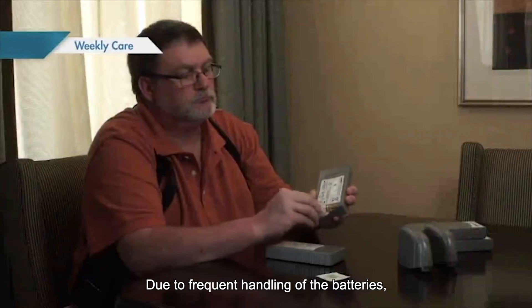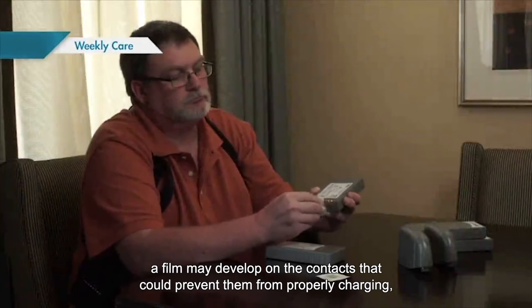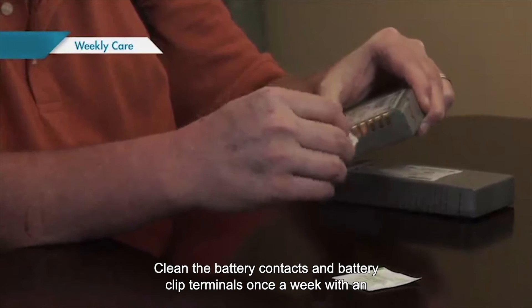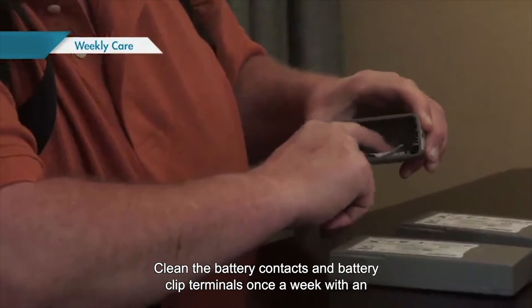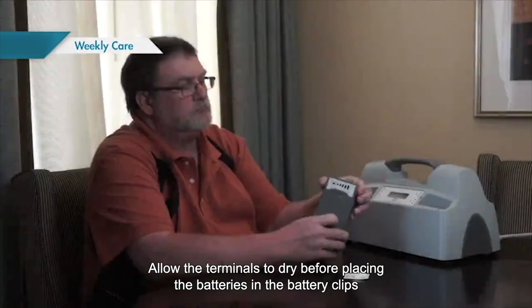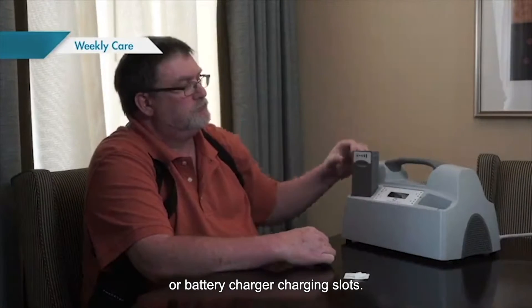Due to frequent handling of the batteries, a film may develop on the contacts that could prevent them from properly charging or working properly unless regularly cleaned. Clean the battery contacts and battery clip terminals once a week with an alcohol-moistened swab or lint-free cloth. Allow the terminals to dry before placing the batteries in the battery clips or battery charger charging slots.